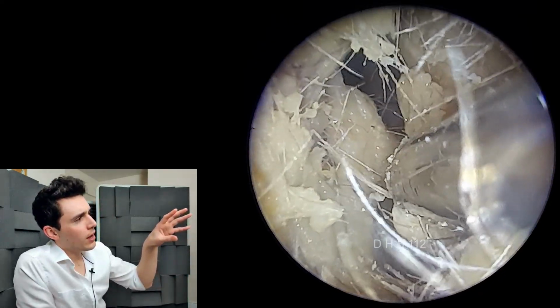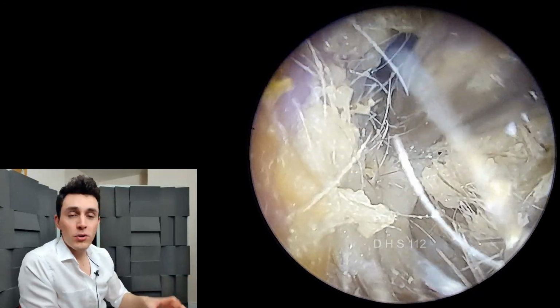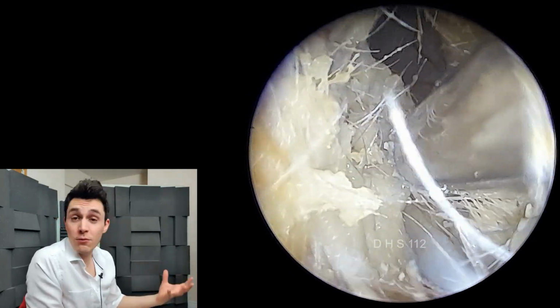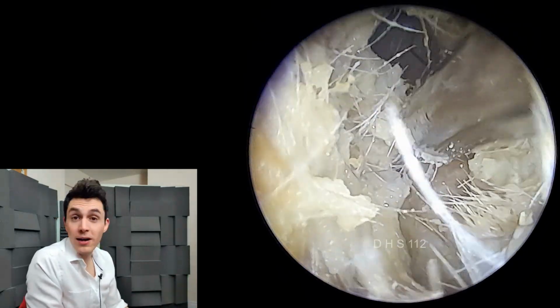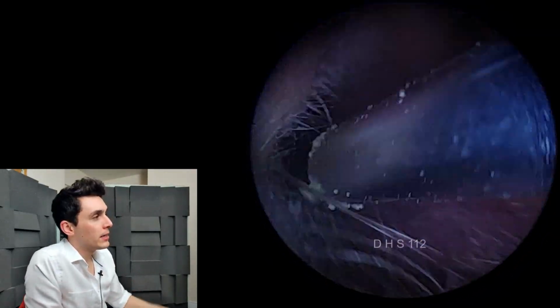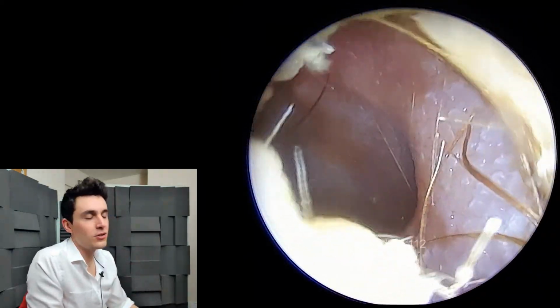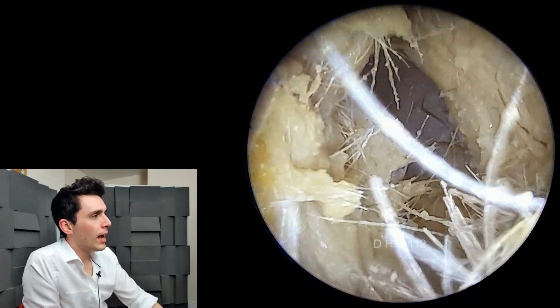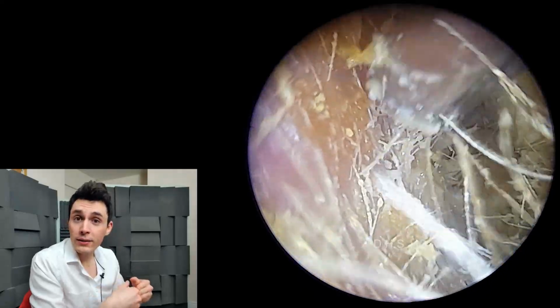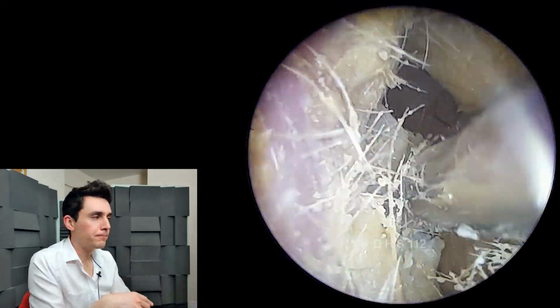So I've shown a couple of cases very similar to this before, but just to bring you up to speed, this is something we call acute diffuse desquamation. So desquamation is just shedding of skin, which is derived from the Latin desquamare, meaning like taking the scales off a fish, so that's where the word comes from, desquamation, shedding of dead skin. And acute diffuse just means that this desquamation has happened very quickly within a short space of time, and it's happened throughout the ear canal, not just in one little segment.